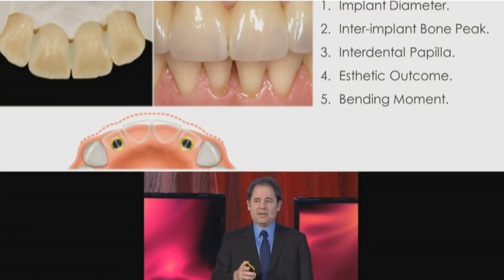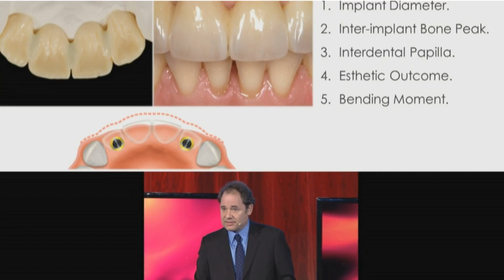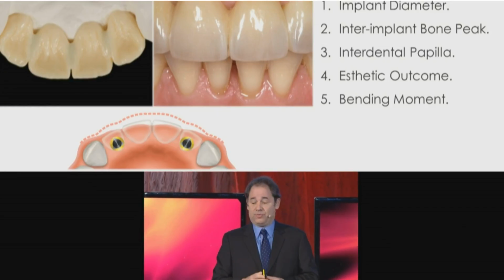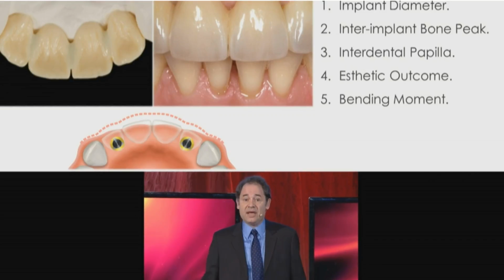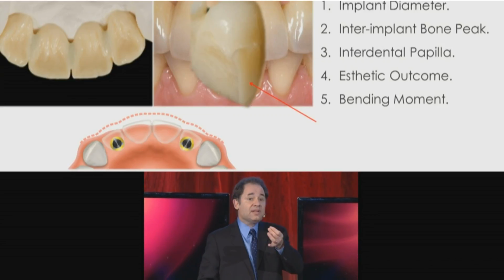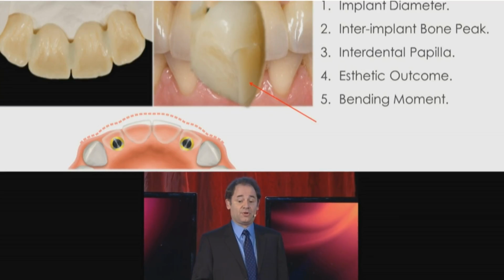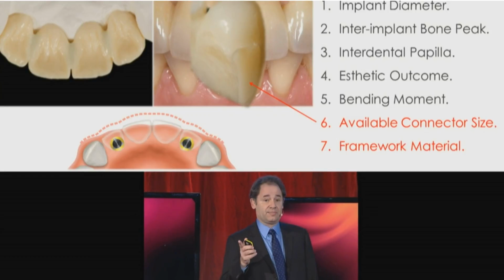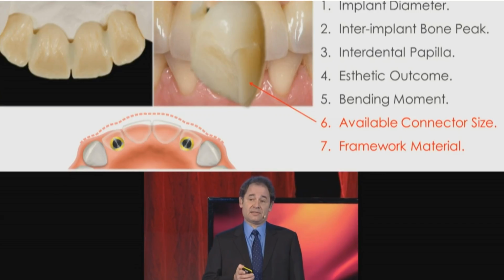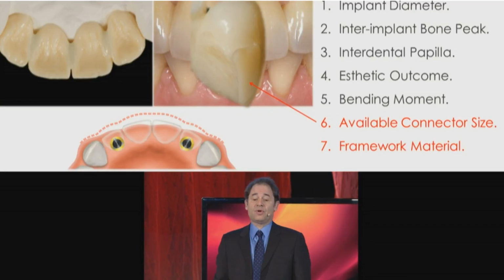What happened here is that, and I'm speculating, the ceramist is trying to give you better aesthetics. So they carve deeper into the embrasure between the centrals. And what do you get? Well, you get a connector size that gets smaller. And all this is telling you is that whatever that connector size was, it was not enough for the patient. So add to that checklist: how much connector size are you going to generate if you use that system? So watch out with your lower incisor. Remember the guidance? And finally, what framework material will you select?